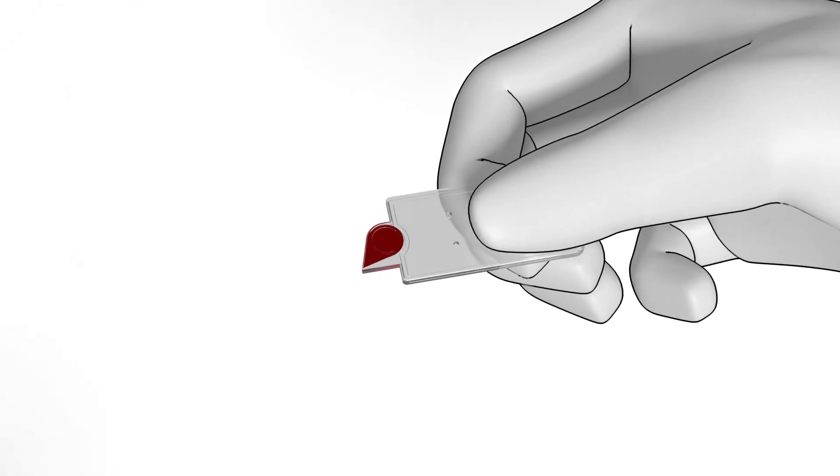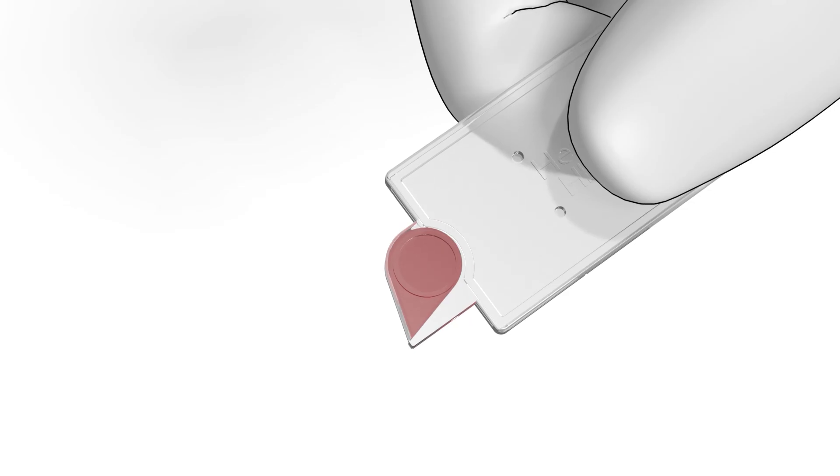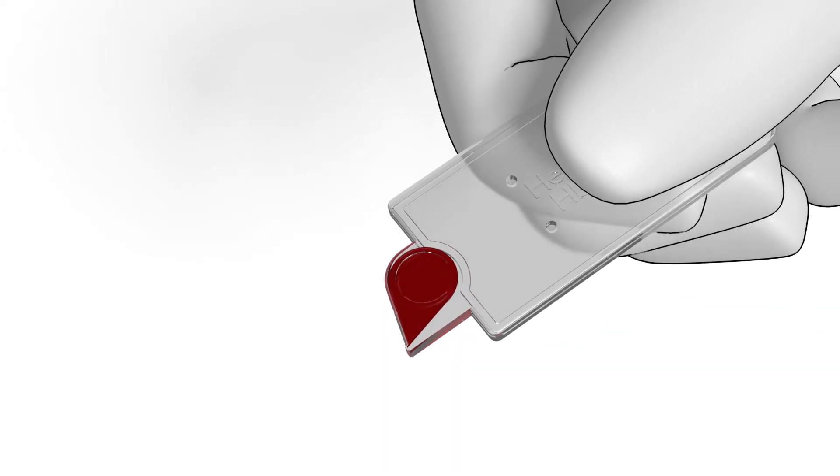Make a visual inspection of the micro-cuvette. If there are bubbles or if the cuvette is not completely filled with blood, discard and fill another one.